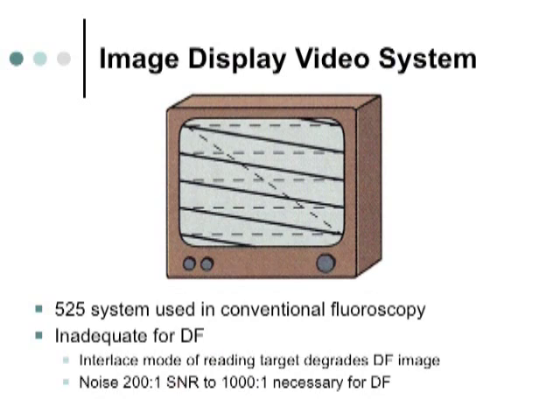They scan from top to bottom, all lines at once. It takes 33 milliseconds to scan, but there's no interlace in that, and it has a higher signal-to-noise ratio. So no interlace scanning like this old system was, where we scan from side to side and front to back, and a lower noise ratio.